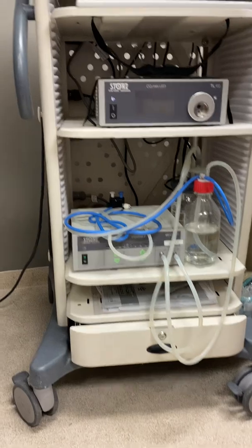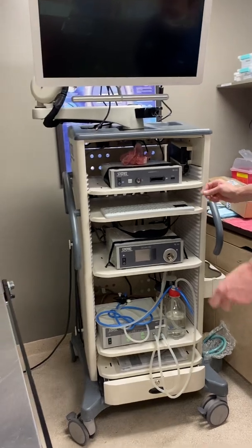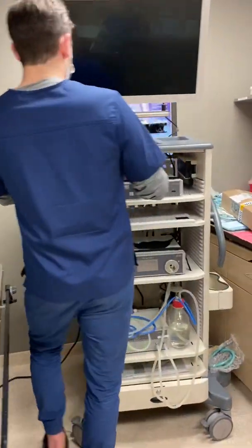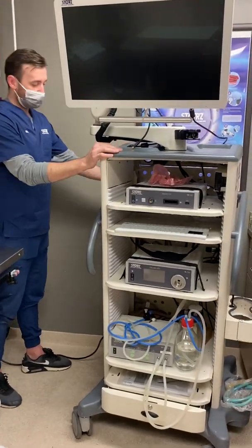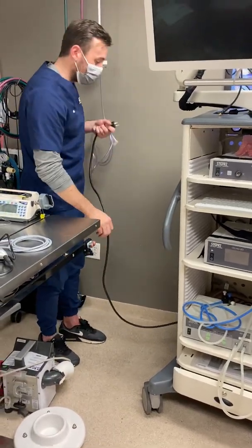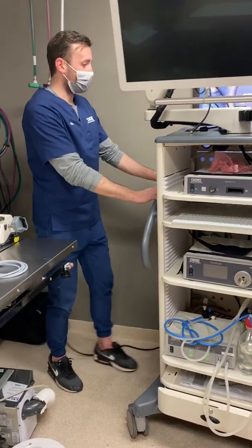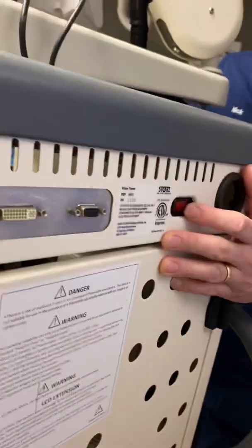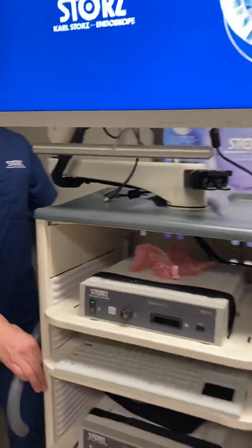So those are the boxes on the storage tower. The cart itself is a smart cart, which means all of the separate units are plugged into the back of the cart. All you need to do to turn the entire system on is plug in the black power cord on the side of the tower, and then press the red button on the back of the tower — that turns on all of the boxes.